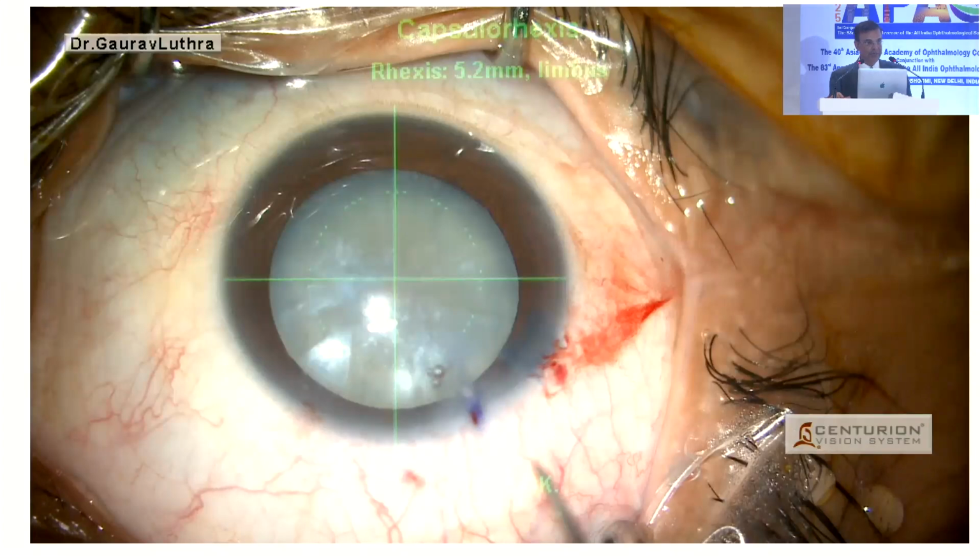So I think that way is... Till how many hours, David, do you lock it by capturing a 3-piece, the optic, and with the haptic in the circle? Yeah, I think this is a tough case because the CTR makes it look so good at the end of the case, and I think we're all concerned about will it stay that way. But you have a good approach, which is with that CTR, and you can always go back unless it really drops down.